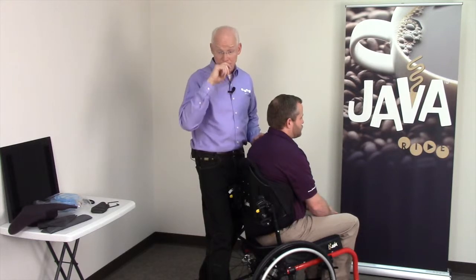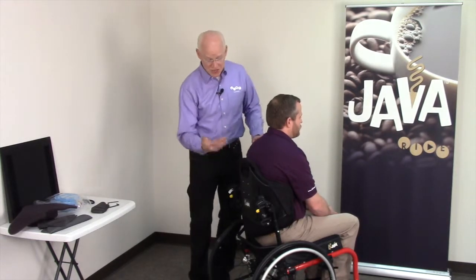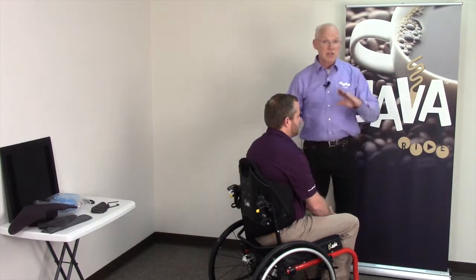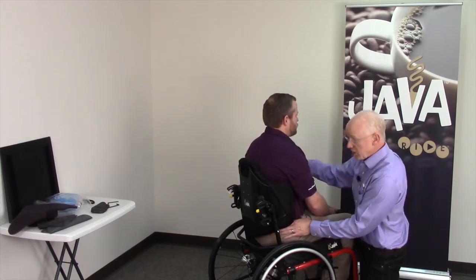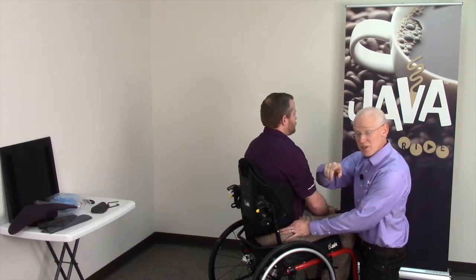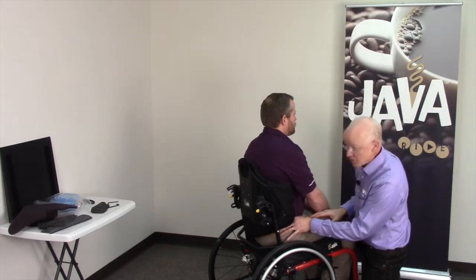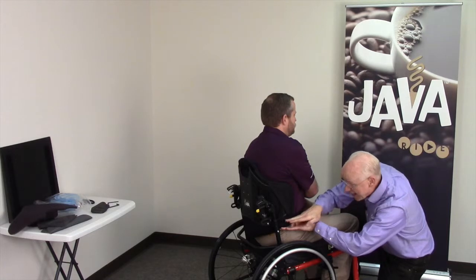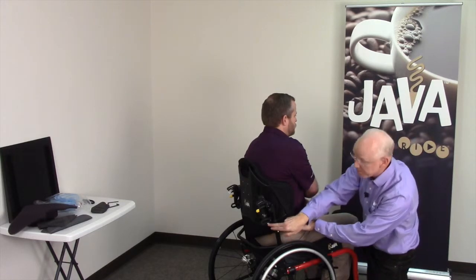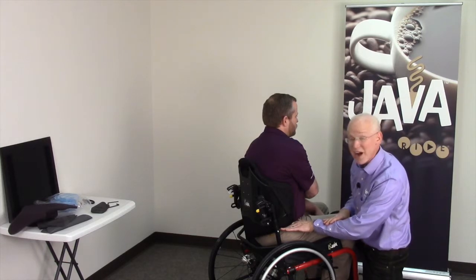So the next thing I need to do is adjust my back height. I'm going to adjust my back height to get it to about the height of the PSIS. As we know, in an upright neutral pelvis, the PSIS is about the same level as the ASIS. So if I find Ryan's ASIS, I can point my finger straight back, and I can go right back to the pivot, and I can see that this back is about 2.5 inches too high.